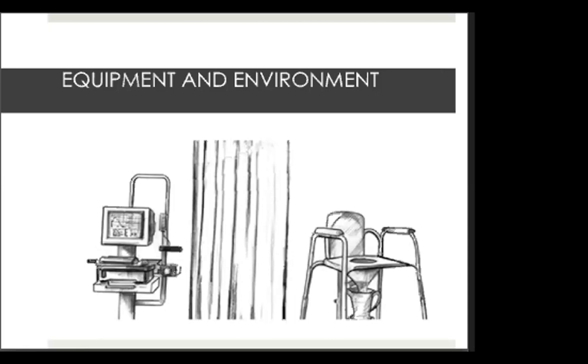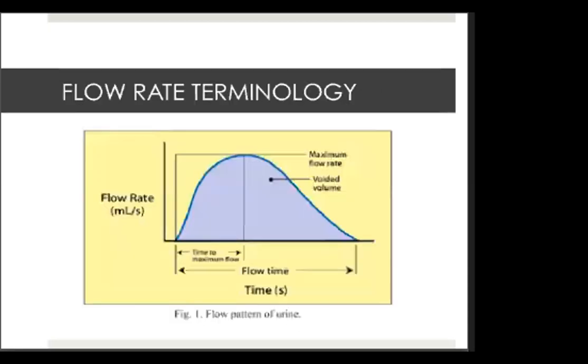So it is also important na i-instruct natin yung patient na dapat void sila pagka ihing-ihi na talaga sila. So it is important lalo na pagka nagpe-perform tayo ng uroflowmetry kasi minsan yung patient hindi pa talaga sila ihing-ihi pagka mag-void na sila. So dapat maganda yung instruction na ibibigay.